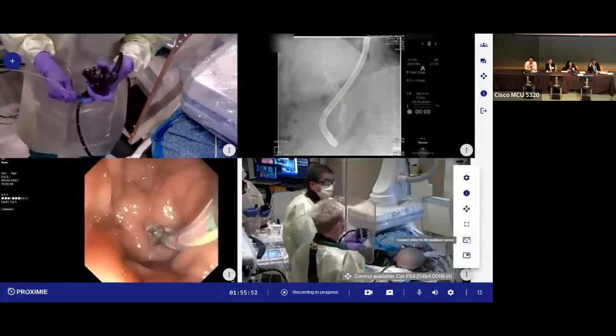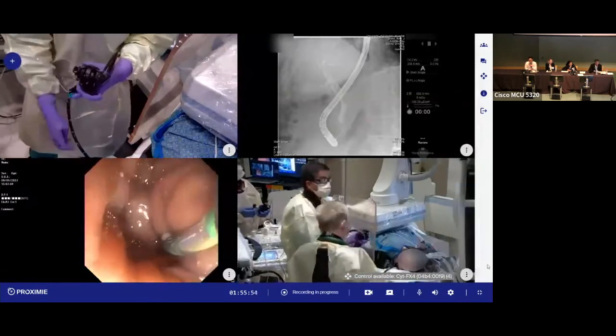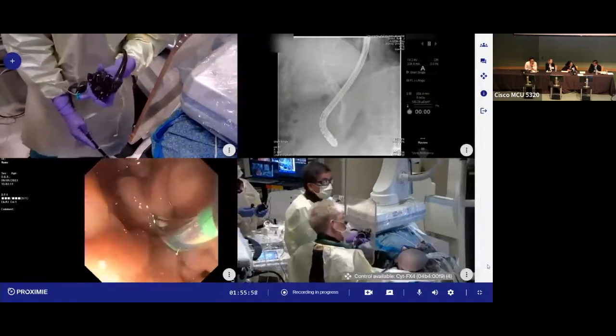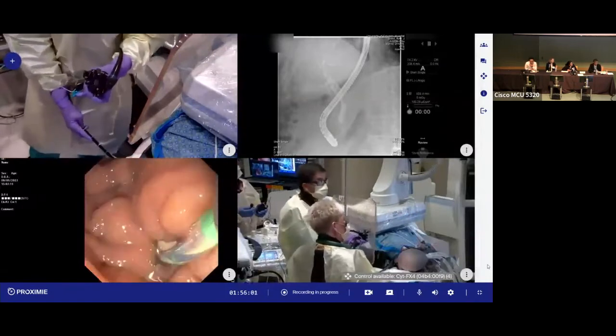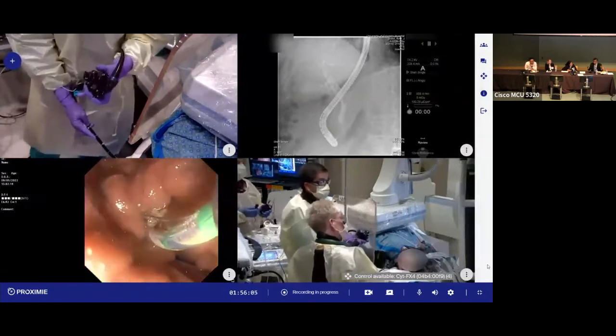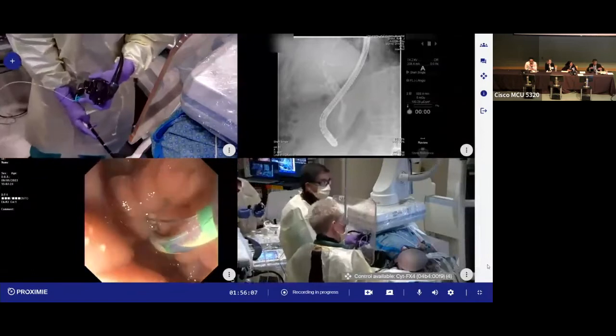Okay, so here we go, up a little bit more. And as everyone's voting to cut more, tell me, what are you looking at? Are you looking at the millimeters? There's a lot of consensus there. I mean, I almost feel bullied. I think it's just room at the end of the bile duct is what we're looking for.